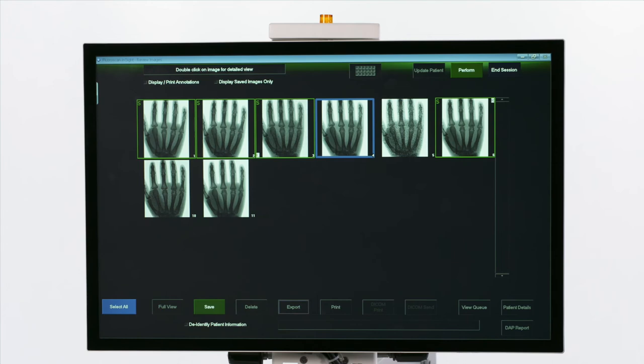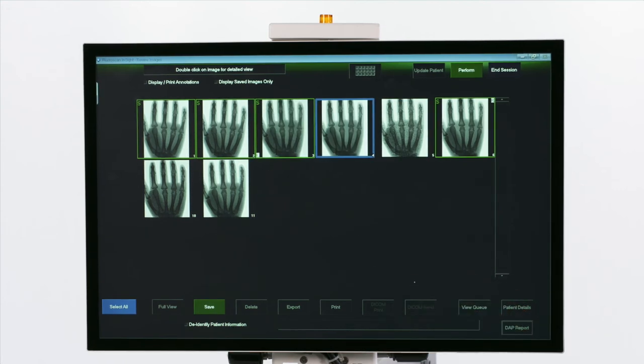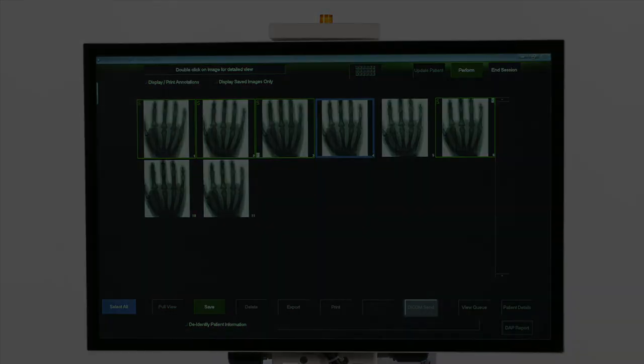Press the DAP button to look at the DAP report. This will show the patient dose and exposure time. Press the DICOM Send button to send the selected images to a DICOM system.